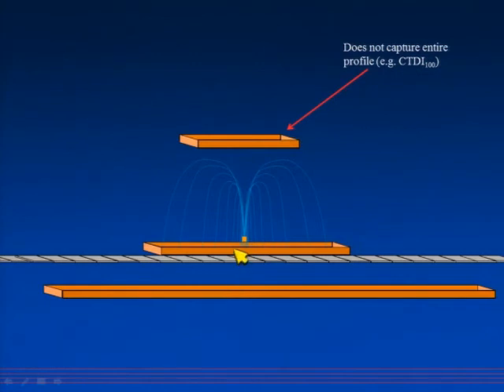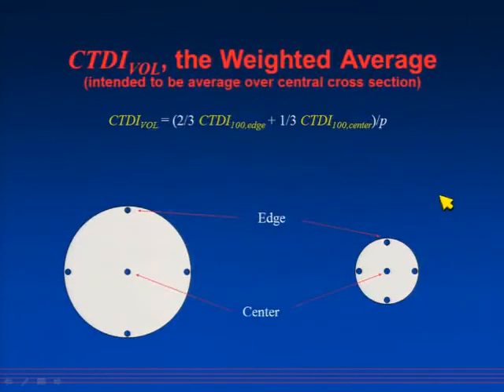That sort of corresponds to the height of this. But that's why, when you look at the CTDI100 equation, the length of the chamber comes into play here. I don't have time to go into that any further, but that's the reason the length of the chamber is in the equation.